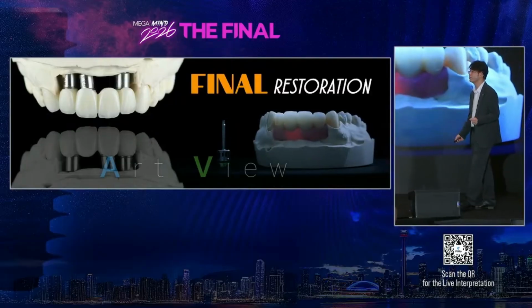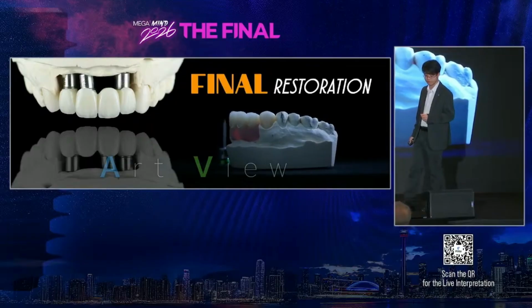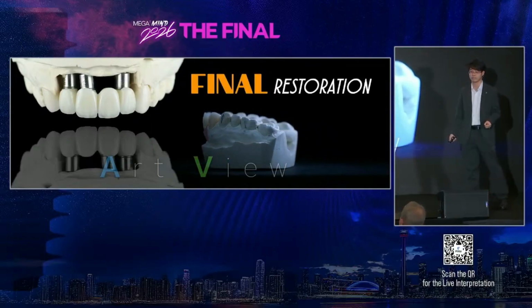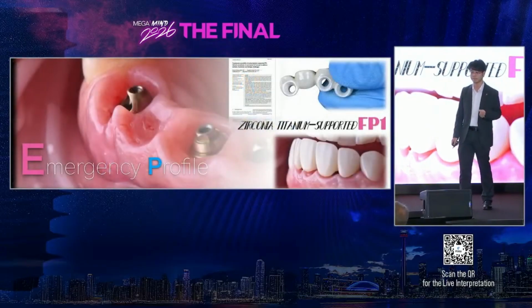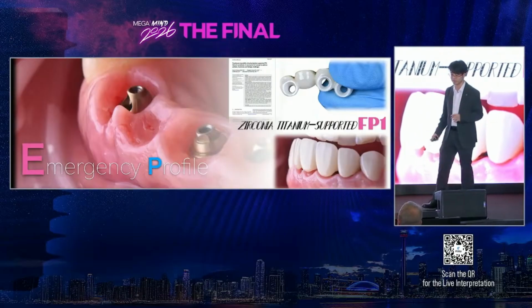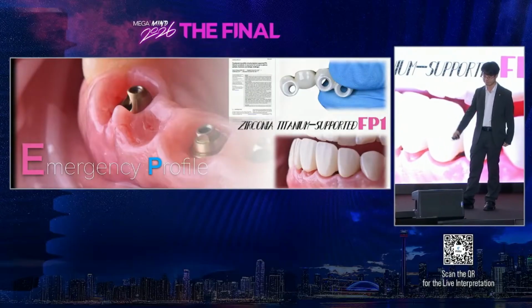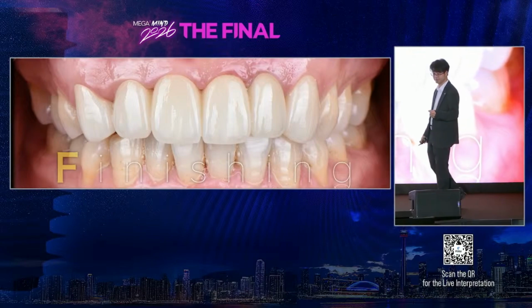And this is the final restoration and an art view, because we need a beautiful aesthetic result. And with the titanium support FP1, this is the bridge, we use the zirconia, and for the abutment connection, we use the titanium. And this is the finished result.